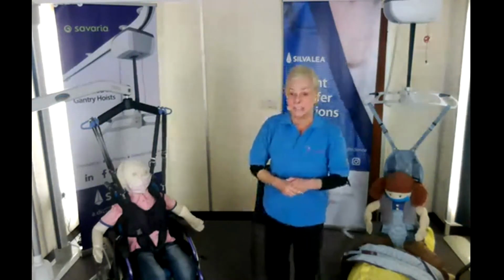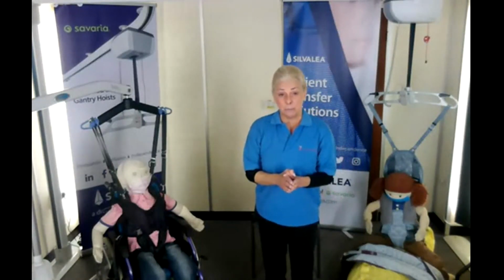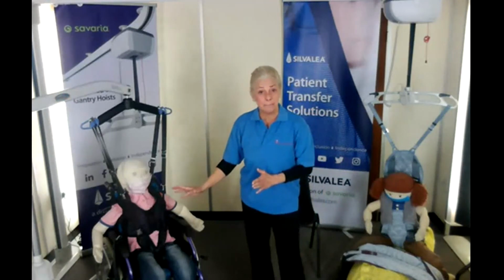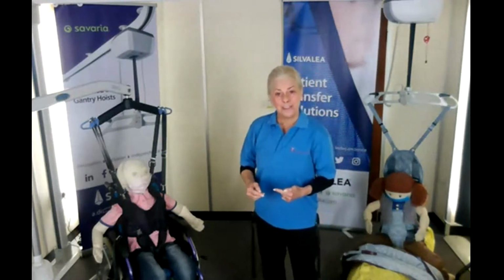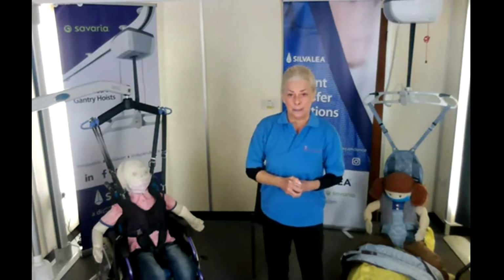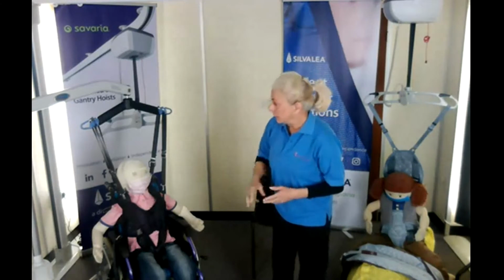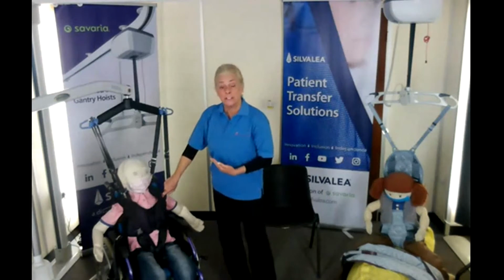So if they're doing activities, then they're supported by the jacket, and then they can carry out their activities rather than trying to control their movement. So useful in that respect. To help stand, walking. You know, some harnesses, you don't need to be weight bearing as long as you can feel their toes, because it helps with well-being, muscle strength, things like that, inclusion. So, you know, the harnesses are really popular for therapy as well. Good for walking frames. Yeah, also for transfer to walking frames.